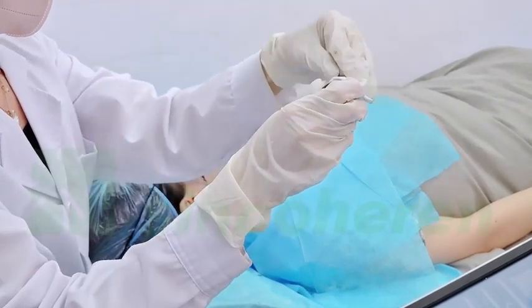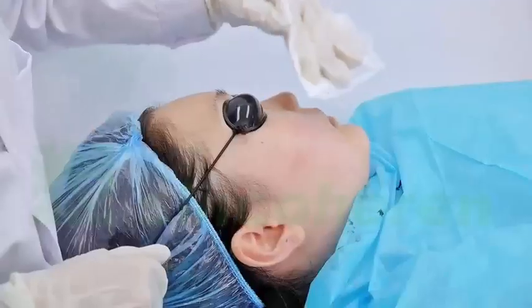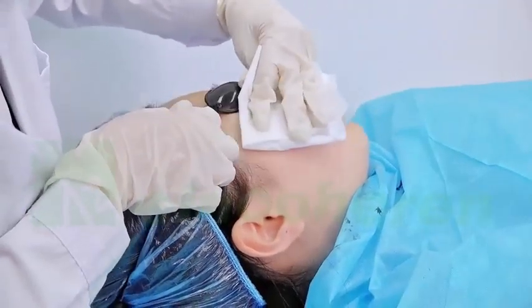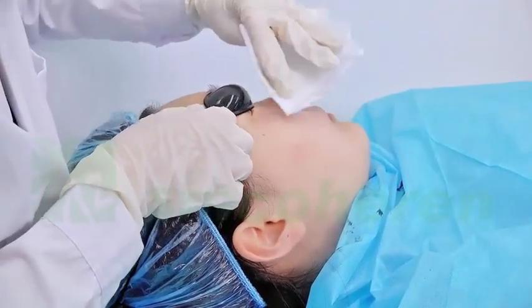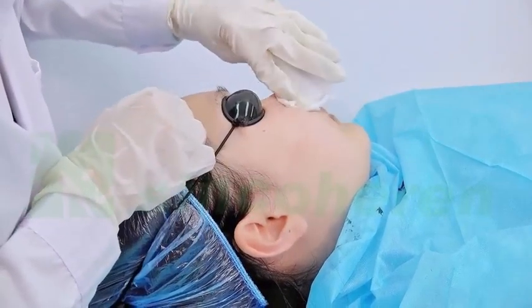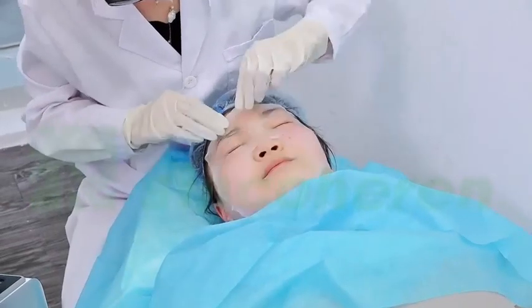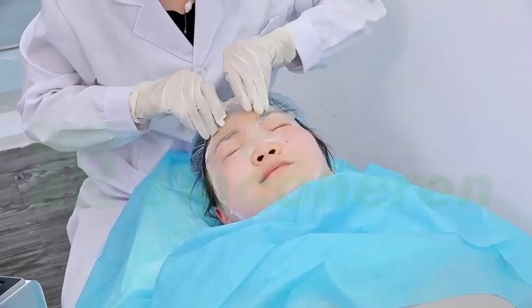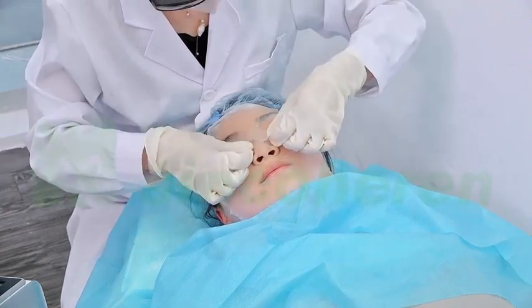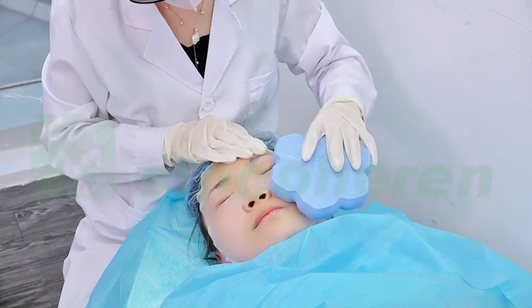The doctor is cleaning up the carbon on the handpiece in time. After the treatment, clean the face again. The carbon and the dirt in the pores become tiny particles, and some residues will come out with the metabolism. After the treatment, the doctor uses mask to hydrate, cool, and smooth the skin.